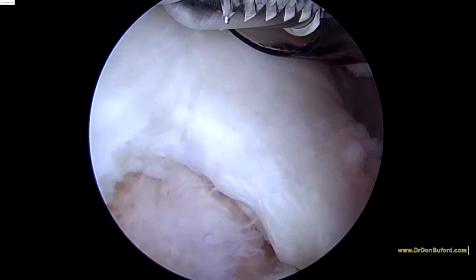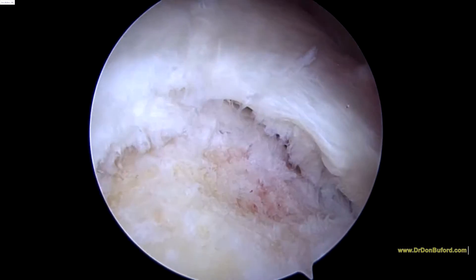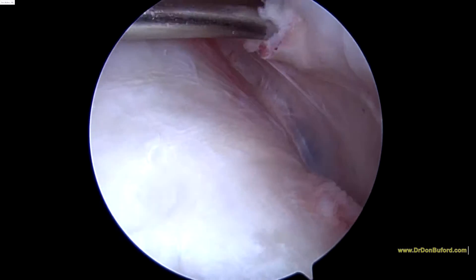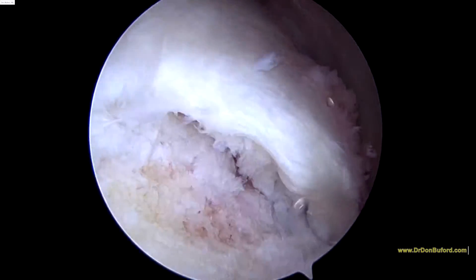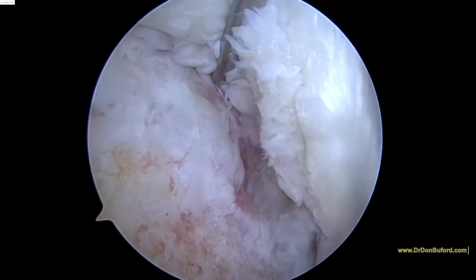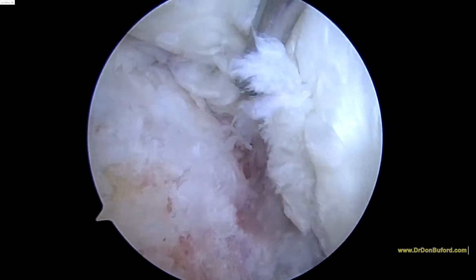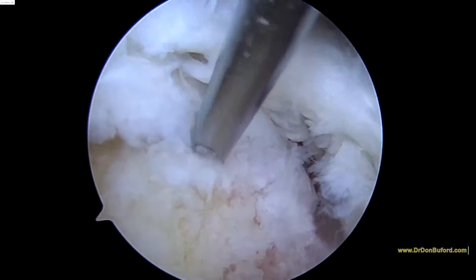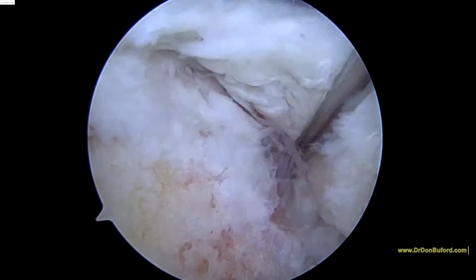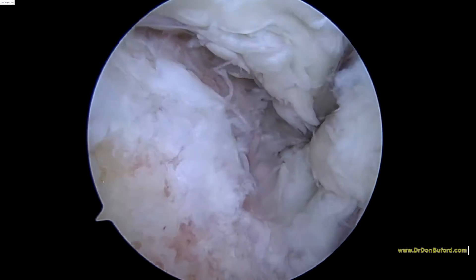I'll keep working here and show you some more in a minute. So here's the hole in the tendon, and we're going to fix this right here. First, we're going to put in a slightly bigger channel in the back of the shoulder. There's the hole right there. Exploring this tear, you can see how the inner part or the central part of the tendon is pretty beat up in there. It does look like the tear stops right there.